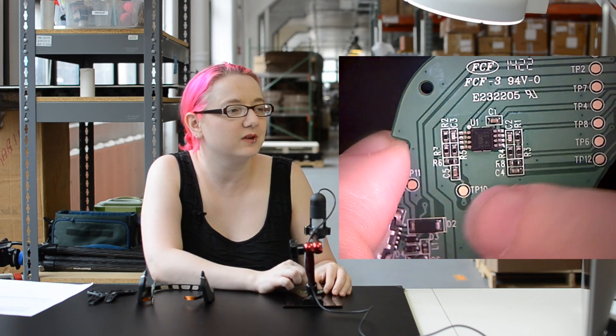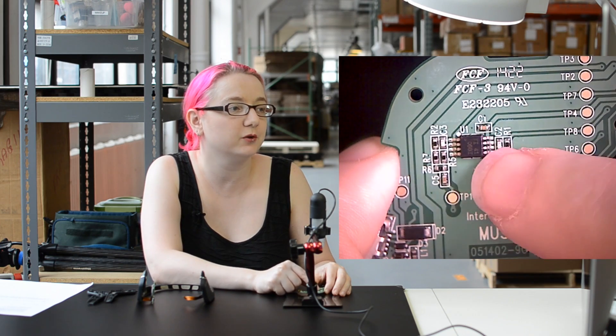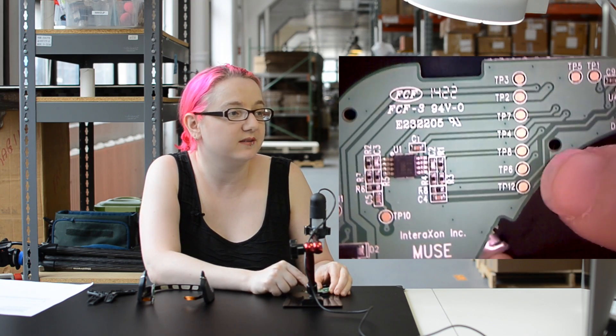Given all of these resistors and capacitors here, and such test points, and the fact that they probably do have to test the electrodes, this is probably an op-amp of some sort, either a single or dual op-amp, amplifying or buffering the signals so that these can be tested during assembly and manufacture.